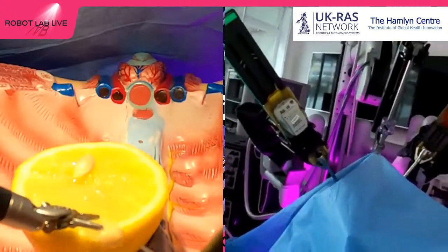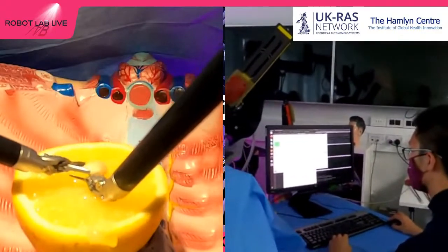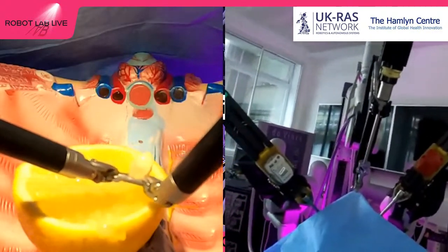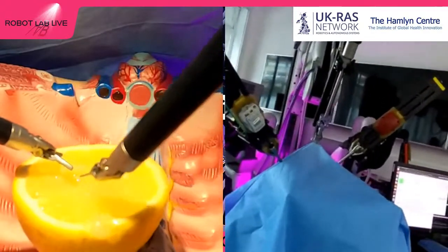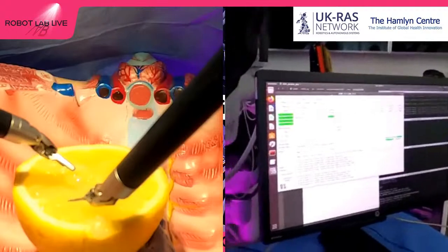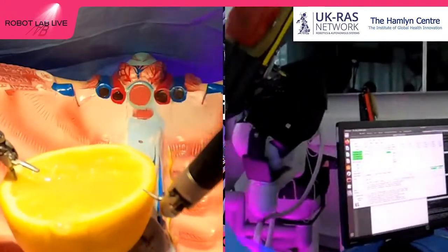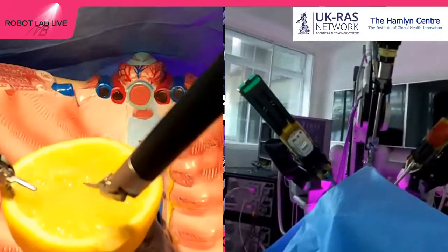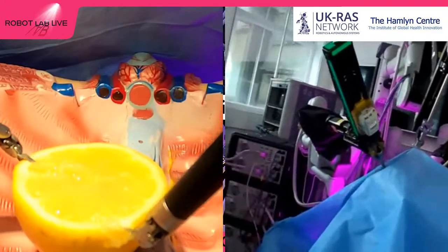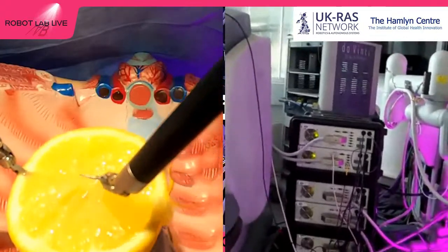So in that area, our friend Sejan is doing some amazing research on how to teach a robot where to go, where not to go, and of course account for all the movement in tissue, because these no-go areas will change as the patient breathes. And you can see it's very cool, all the controls that Sejan is working on at the moment. Of course, this is something that you will not have in an operating procedure where everything is already implemented. But in our case, since we're investigating with it, we keep control of everything. And we have here all the control boxes that are used to send the signal to the robot.